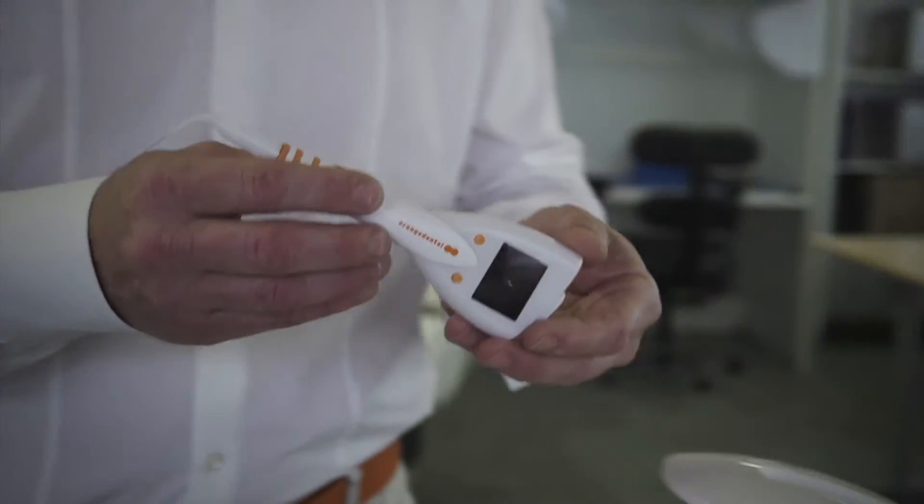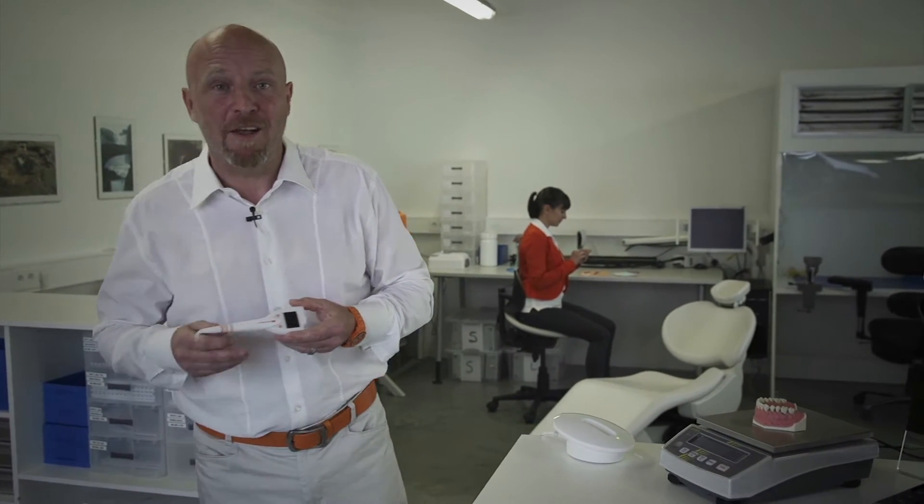Our fully optimized periodontal probe Paon can make your life so much easier. You have to see this. How it works? Of course, fast, simple and easy — and it makes a lot of sense.